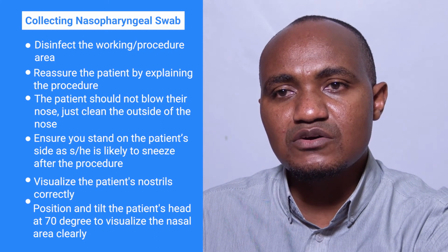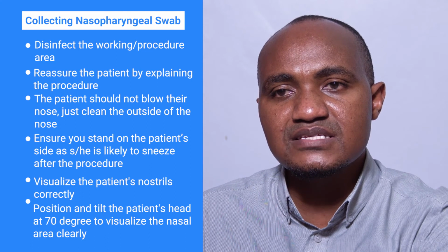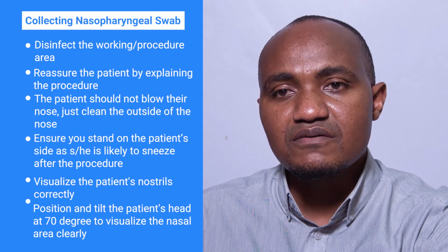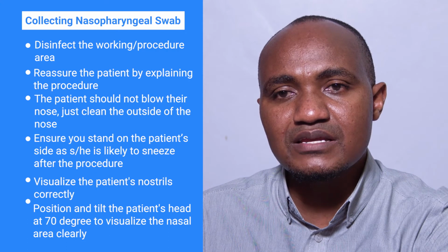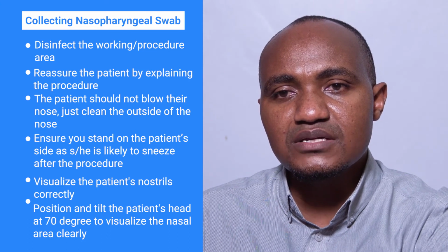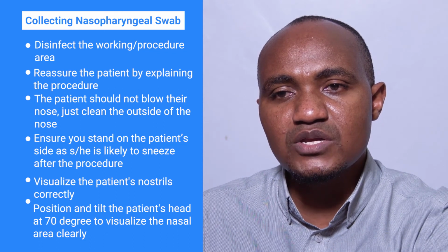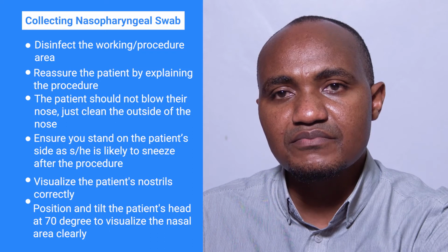Ensure you stand on the patient's side as he or she is likely to sneeze after the procedure. Visualize the patient's nostril correctly. Adequate lighting is necessary. Position and tilt the patient's head at 70 degrees to visualize the nasal area clearly.